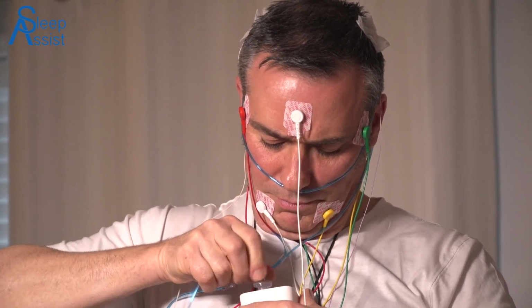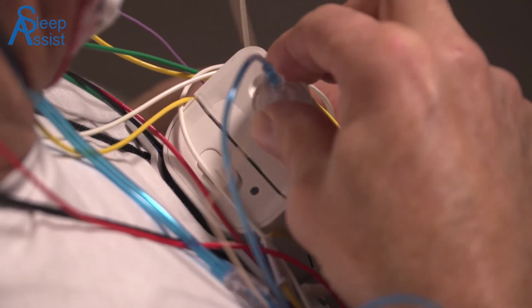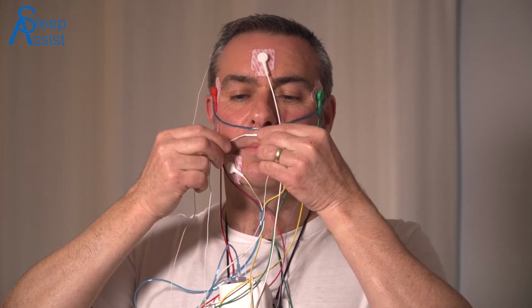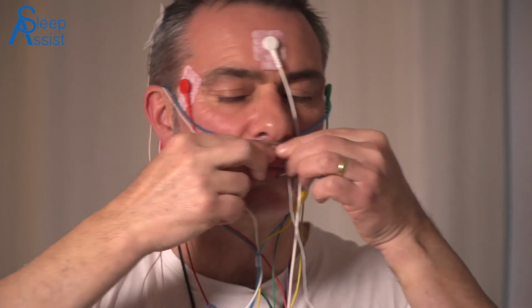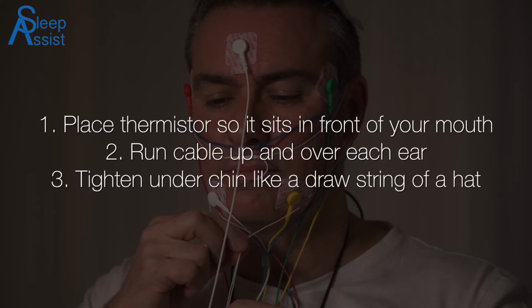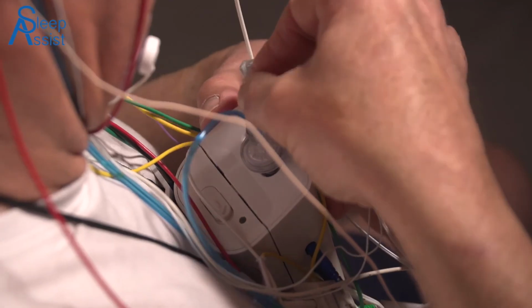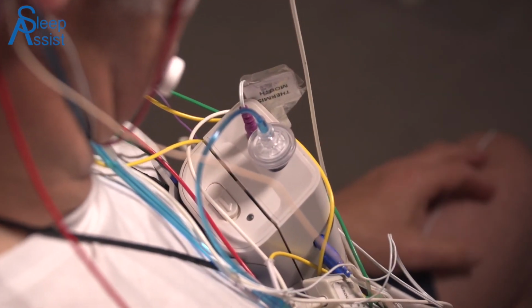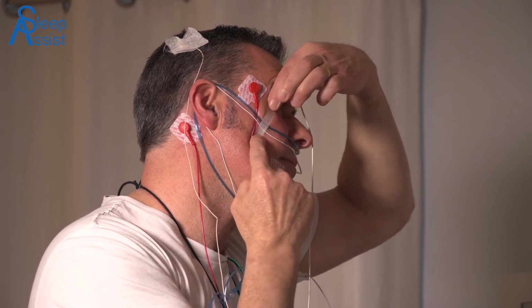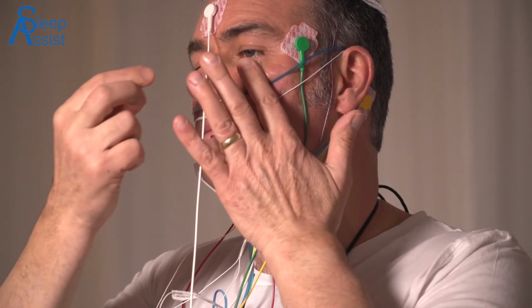Connect the nasal cannula tube into the PDX recording device by twisting and tightening into place. Be sure not to over-tighten and break the connector. Run the thermistor along the same pathway as the nasal cannula. The tip of the thermistor should sit just in front of your mouth. Connect the thermistor into the PDX recording device, which is next to the nasal cannula port. Using the tape provided, tape both nasal cannula and thermistor to upper cheeks to hold them in place during the night.